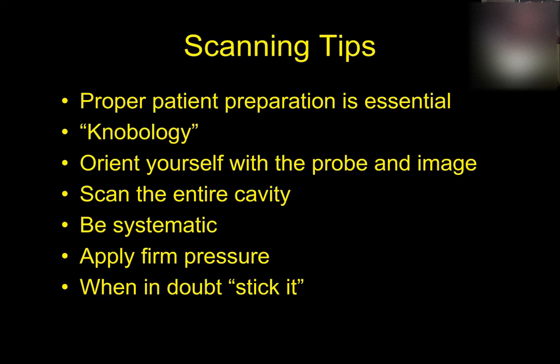So you want to learn the right way for you to do ultrasound, and you want to do it that way pretty much every time for the rest of your career. For me, when I ultrasound a dog's abdomen, I always start in the region of the urinary bladder. And then I go around counterclockwise around the abdomen.